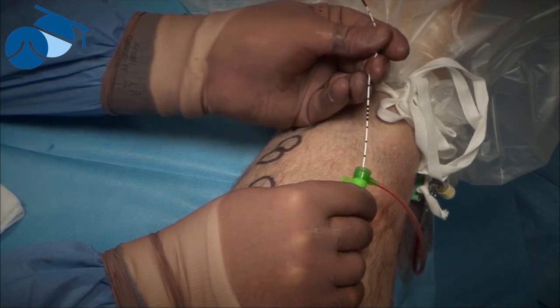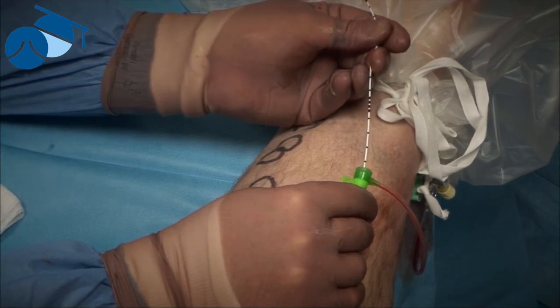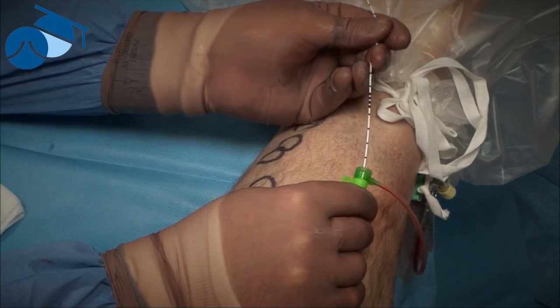So we're down to the 40 centimetre mark. And so we're just above the knee at this point.